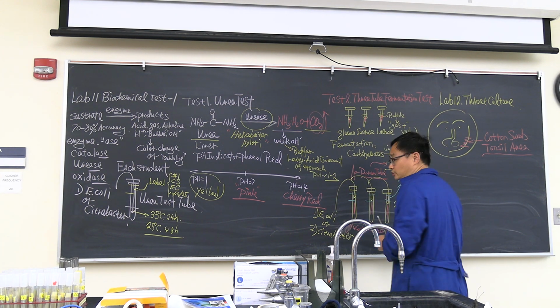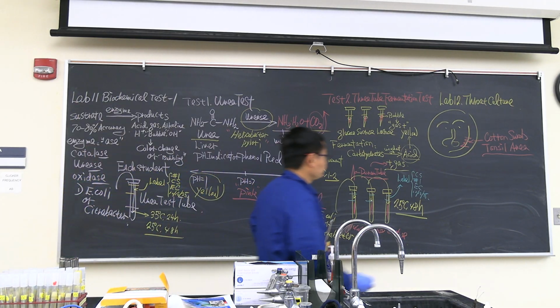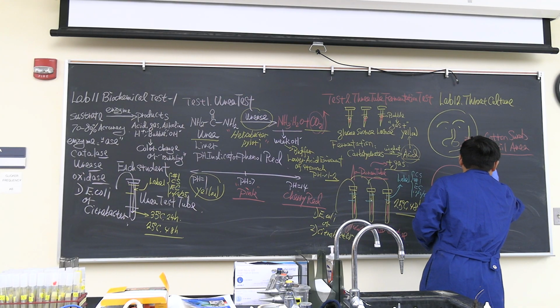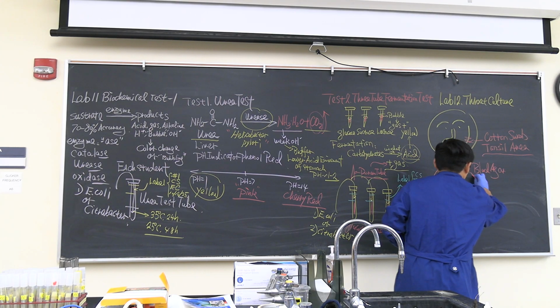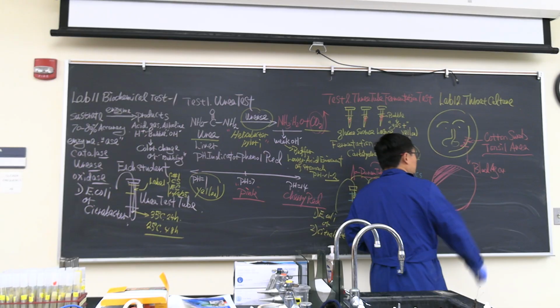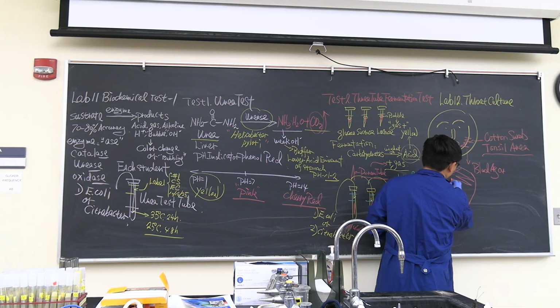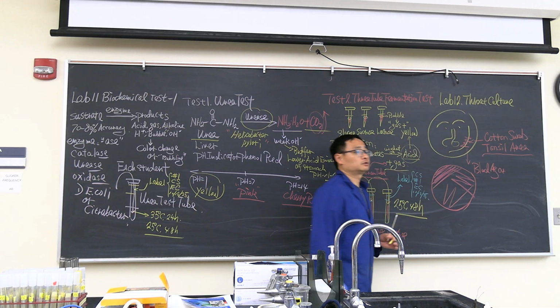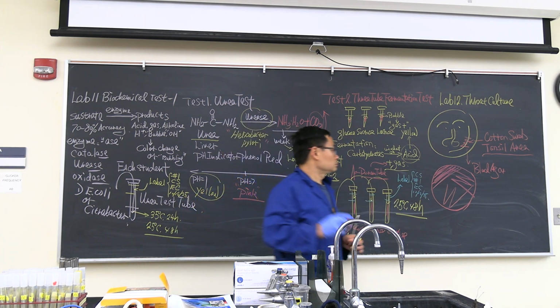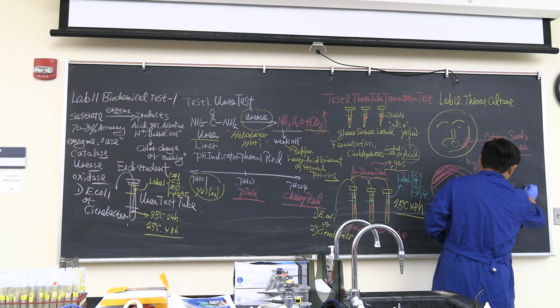After you get it, what do we do? We have a blood agar, and we're going to do the same. Very intensive using the cotton swab to do the first streak. Change to the loop. That's good. Three streaks is enough. Okay? And this we will incubate in a candle jar.